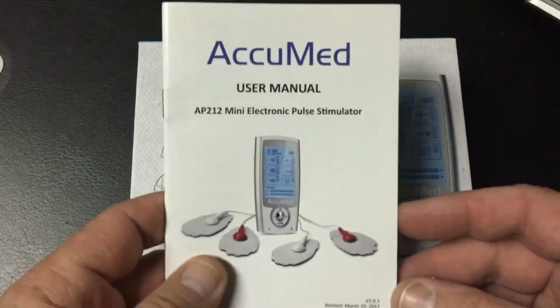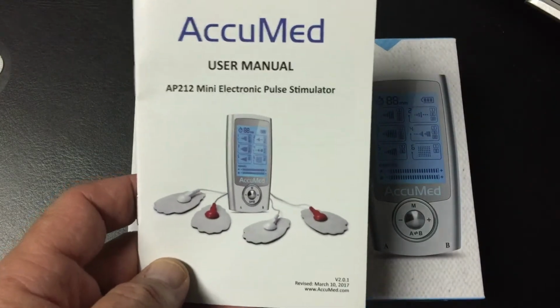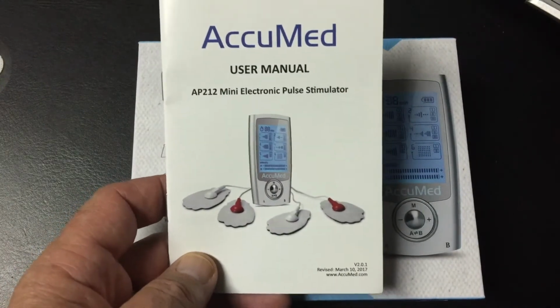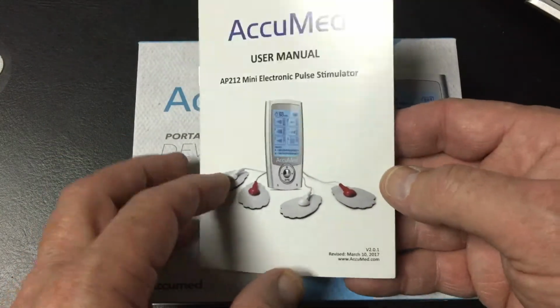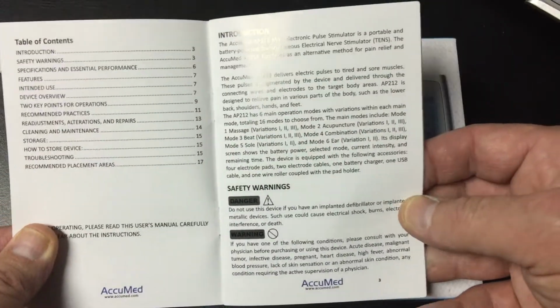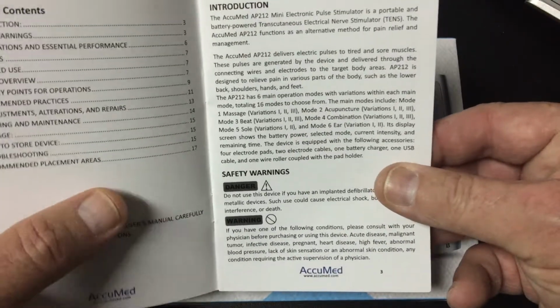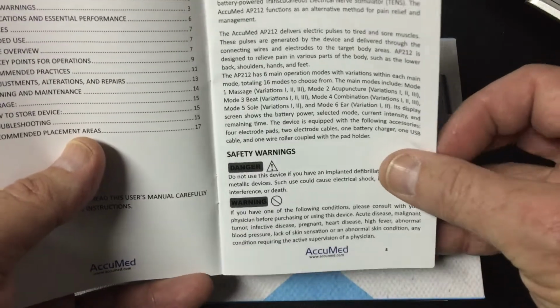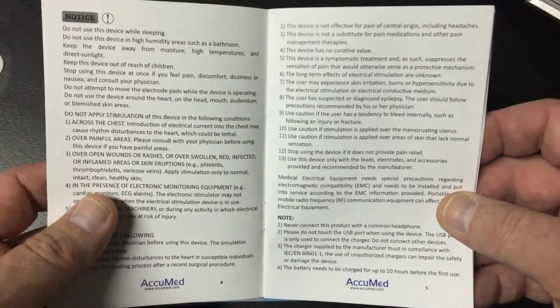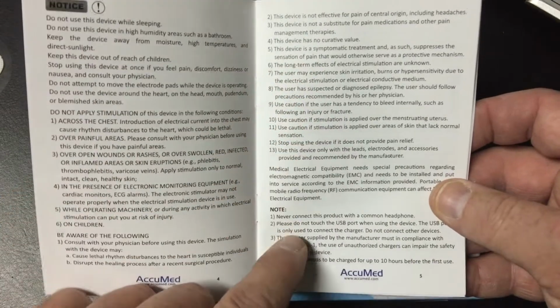Okay, let's take a quick look at the user manual. Now, I know a lot of people don't read these. I've been guilty of that myself. But there's a lot of valuable information inside, so you should take the time to read this manual before you use it. There's a table of contents in the front, of course. And again, the first thing you're going to go through is the introduction of the AP212, and you're also going to have your safety warnings. I encourage you to read through the warnings. Do not use the device until you've fully read all of the safety warnings and cautions.